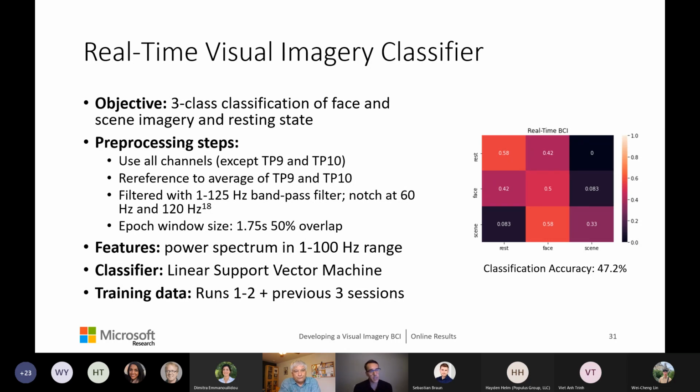Yeah, that's a great question. A lot of times with these EEG applications, you really do see a pretty drastic drop between the sessions. This could be from many reasons, like fatigue during the session, or even just the electrodes being at slightly different positions. So it was pretty cool that, in my data set, I wasn't seeing any drop between that. And honestly, I'm not really sure exactly why we weren't seeing a huge drop here. To make sure that there isn't a drop with visual imagery, we definitely need to test this out on some different participants instead of just myself, and get some more data to actually validate this.